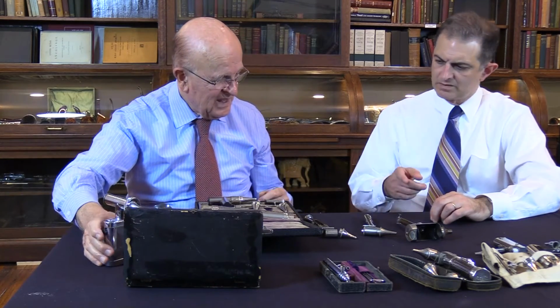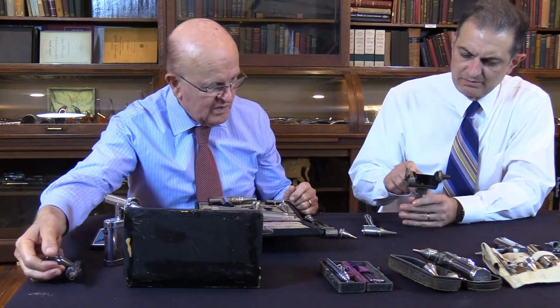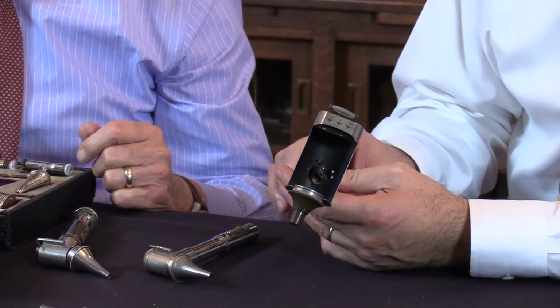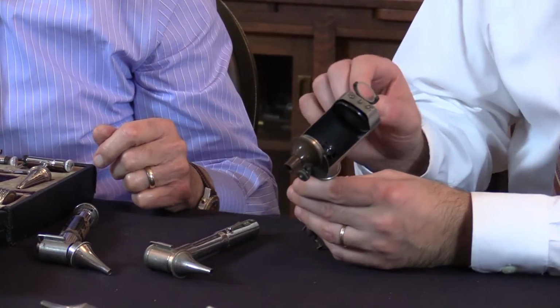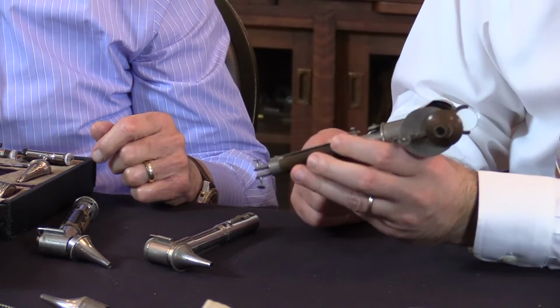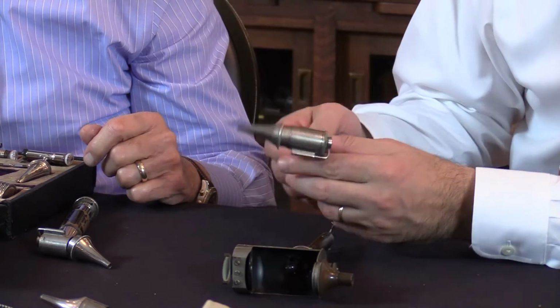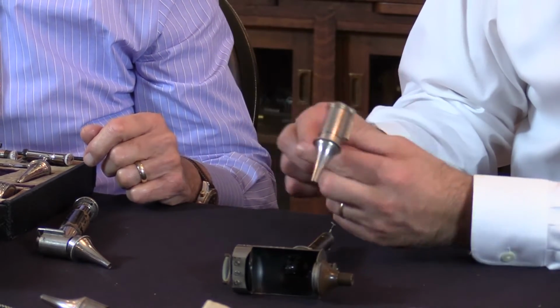Over here we have a similar idea in the sense that we still have a reflecting mirror, but a bulb is in the bottom of this otoscope. This is from the 1880s. You can move your magnifying lens around, and it was electric powered, so at the bottom you connect the electrical input. Similarly, there are light bulbs in these as well, and there's a reflecting mirror inside.